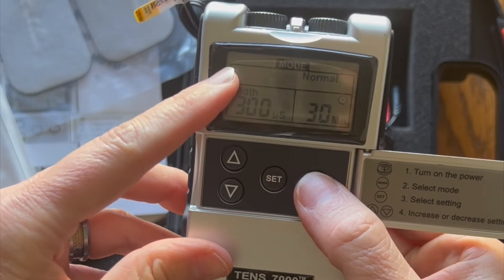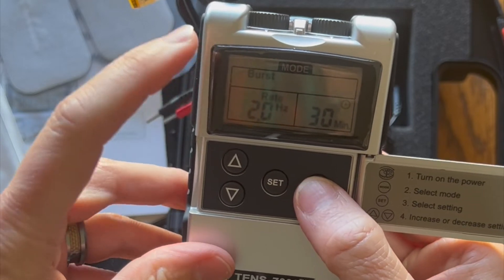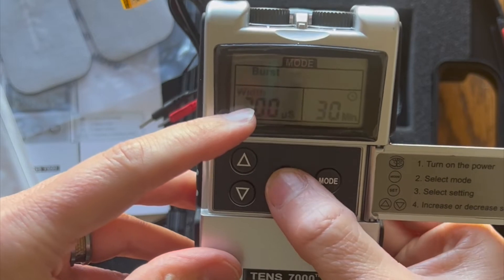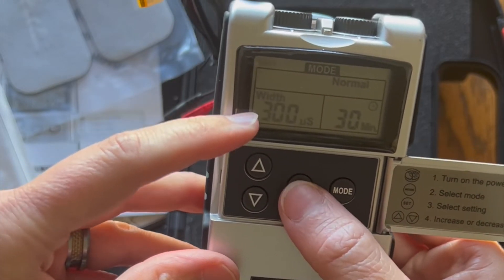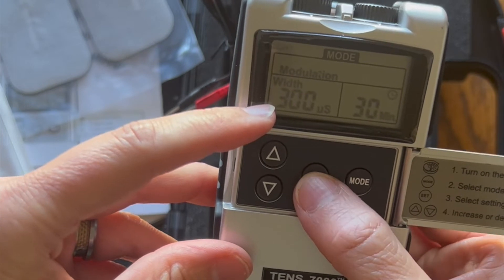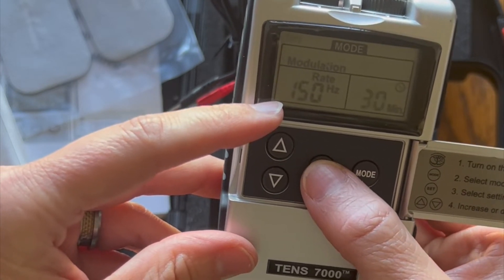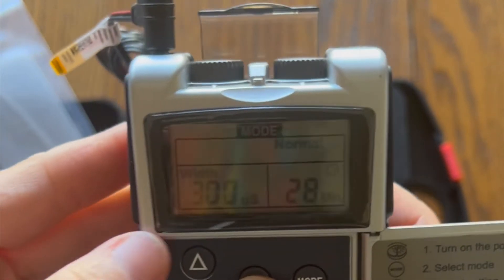If I hit mode, it will take me from burst to normal to modulation to SD1 and SD2. Burst is for periods of extreme pain, so we're going to hit mode one more time to bring us to normal mode, which is where we will spend most of our time. Hitting set again will allow me to change the pulse width, one more time to change the pulse rate, and a third time to change the time.